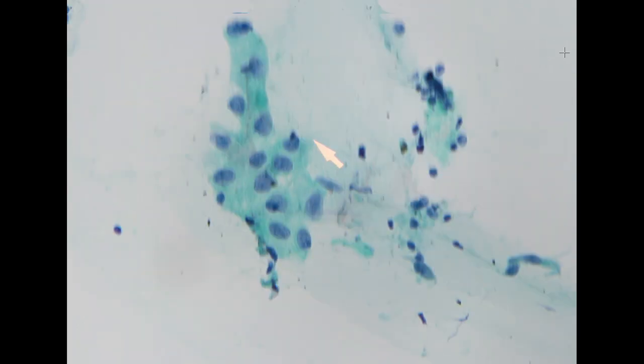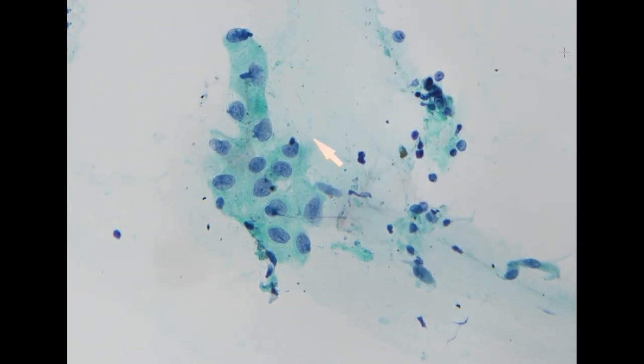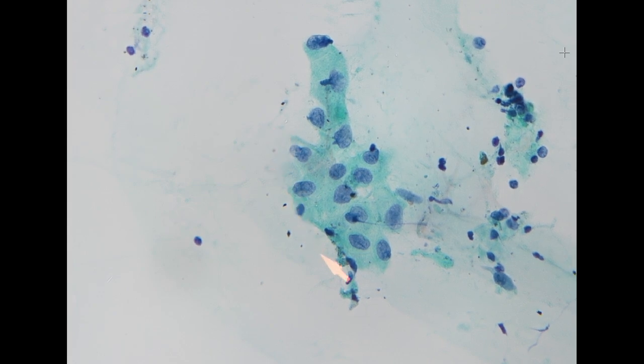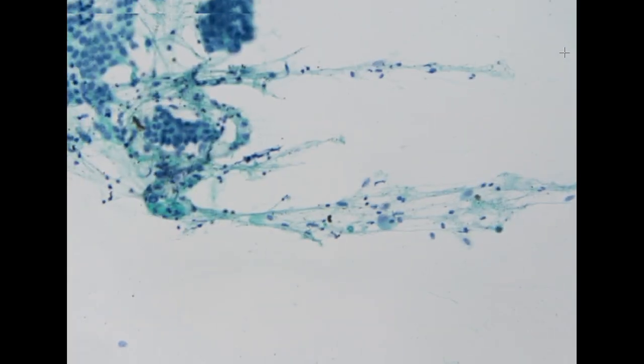On some occasions, if it is a well-differentiated adenocarcinoma, you will still maintain a relatively regular arrangement, but the nuclei are slightly atypical. There is no prominent polymorphism. So this makes the diagnosis sometimes more difficult.